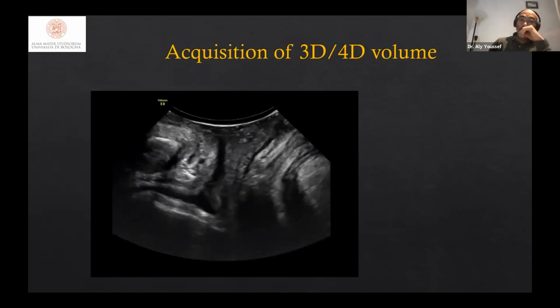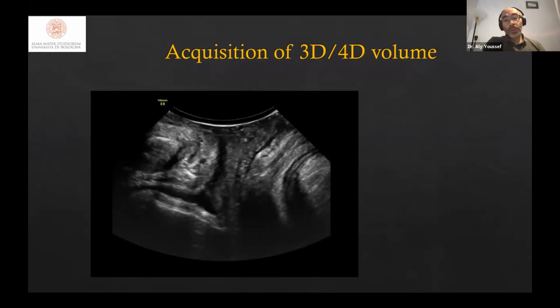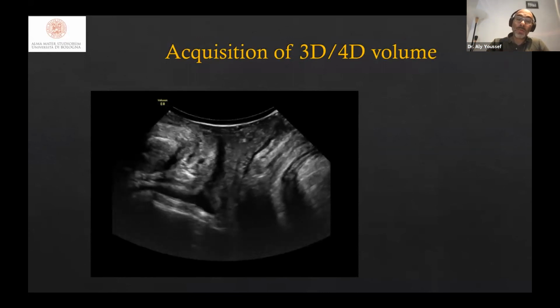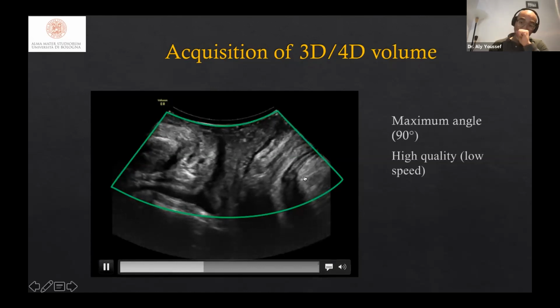The difference between 3D ultrasound and 4D ultrasound is that 4D ultrasound is a three-dimensional reconstruction in time. So you can see movement by 4D ultrasound, whereas 3D ultrasound gets static images. Although the technique from a practical and technical point of view is the same, we need 4D ultrasound in the pelvic floor because we need to assess its dynamic aspect. What we need is to reconstruct the plane of the levator ani muscle, which runs from the symphysis pubis to the anorectal angle.